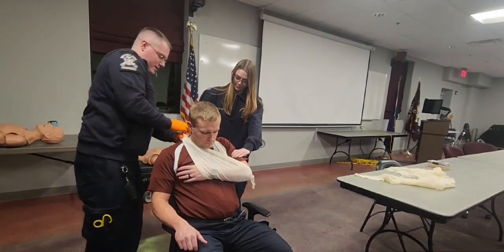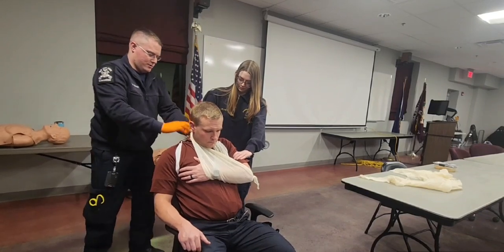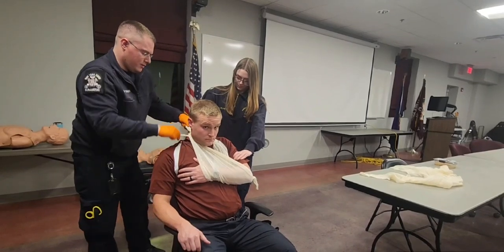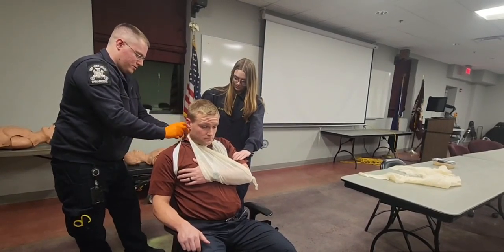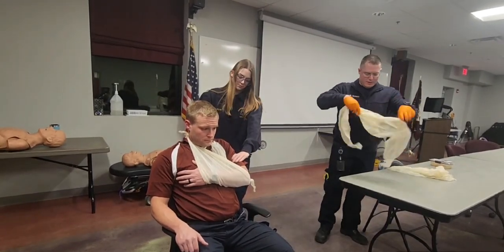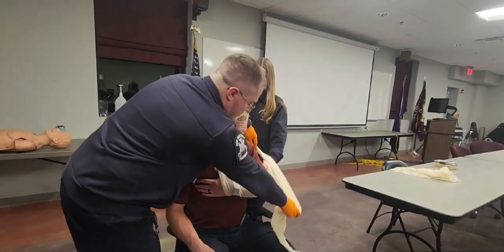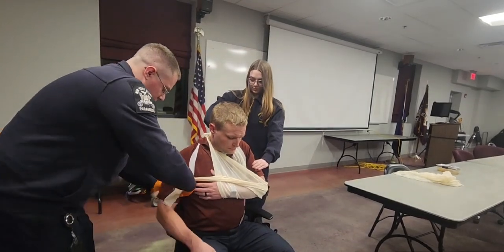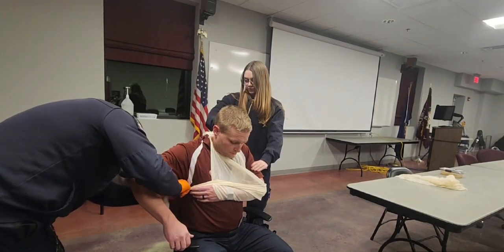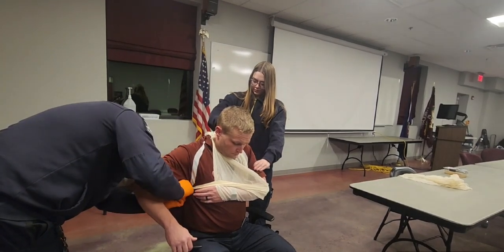I'm going to take out the slack behind and then tie a surgeon's knot in the back. The knot is tied. I'm going to apply another triangular bandage, making sure that I capture the elbow to support the weight, and go underneath his other arm and tie right here. This should support all the weight of his shoulder.